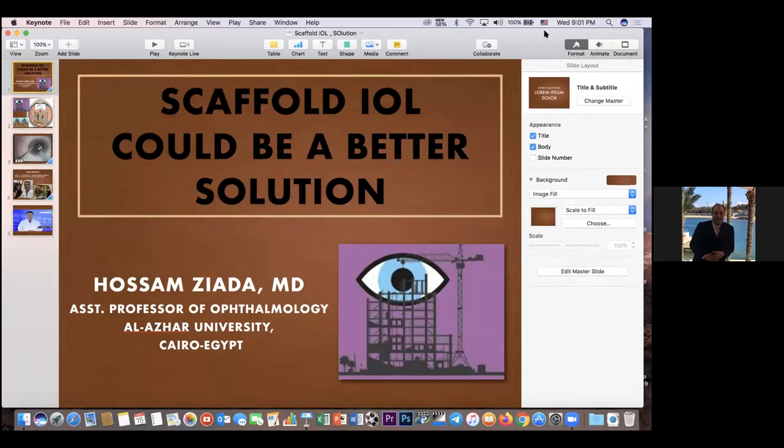Pediatric cataract. Can't we do the posterior capsule by the usual capsule rexis forceps or vitreous cutter? You can do it anyway, but here I think you could do the posterior rexis in any way with this rexis forceps, with the cystotome or with the occutome, no problem. You can do it anyway.